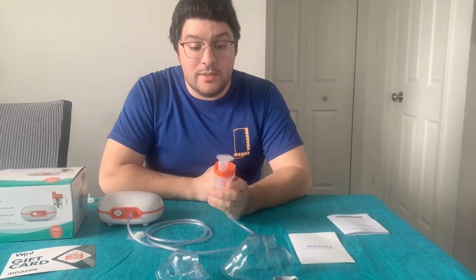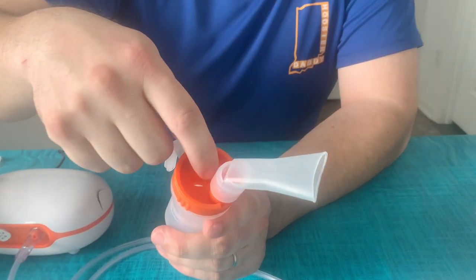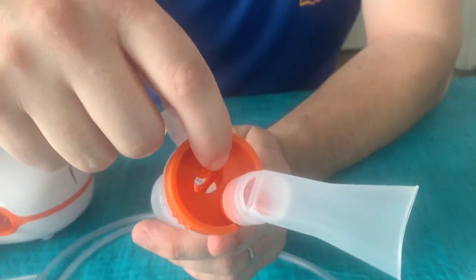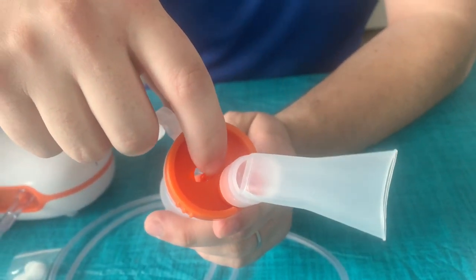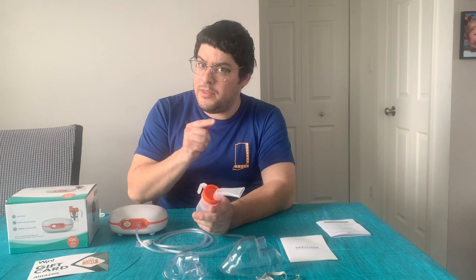Another thing of note is if we look at the top, this sliding door is actually how you adjust the nebulization amount. Whether you need more mist to come out or a little bit less, you'll be making adjustments with that door.